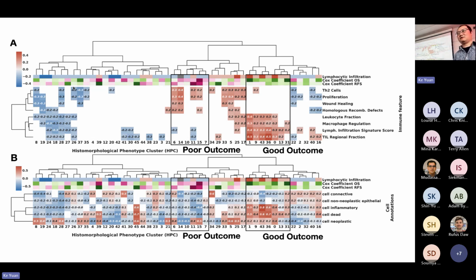the underlying molecular causes. For example, we find the good outcomes are quite often highly correlated with various degrees of immune activities, as highlighted over here. And the poor outcomes are very much associated with signals for proliferation, lots of mutation-related signatures.